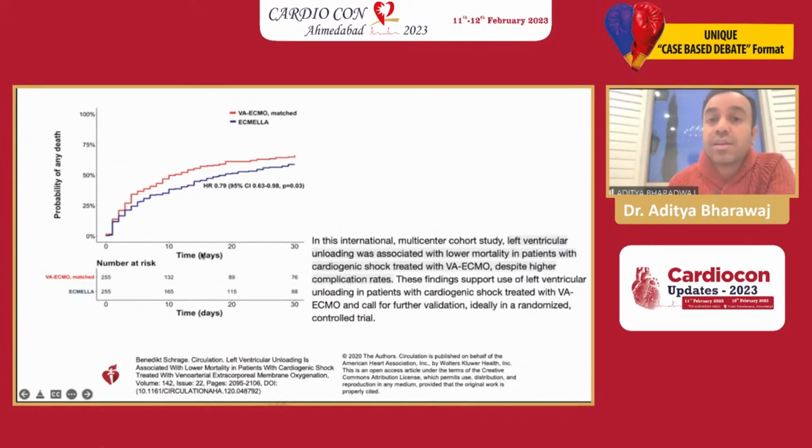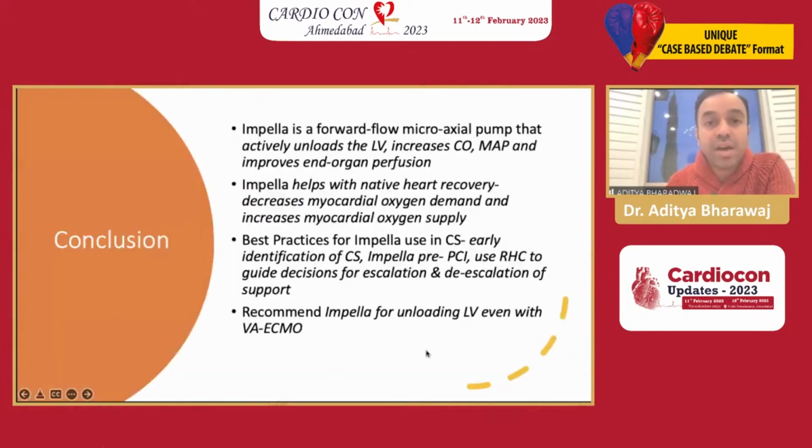This obviously is not a randomized control trial, but this is a large registry of patients showing that an ECPELLA strategy or an ECMELLA strategy is associated with better survival as compared to just VA ECMO alone, despite an increased risk of vascular and other complications. There was improvement in survival.